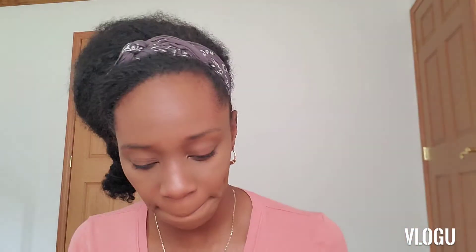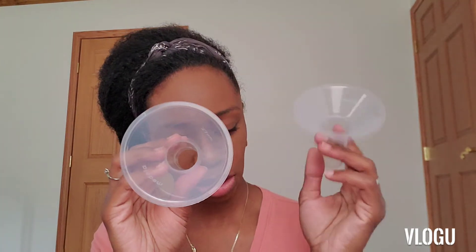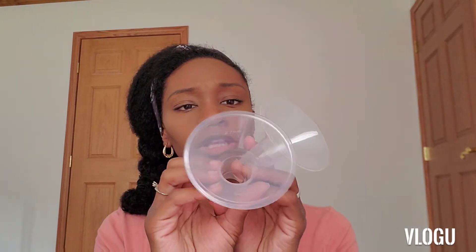The first thing inside is instructions, pamphlets, stuff like that. Next is your pump parts — your cords and pieces to it and everything that you hook to the actual pump. And then you have extra cups that are different sizes than the cups that are in the bag. These are 27 millimeter and the other ones are 24, so these are the bigger size.